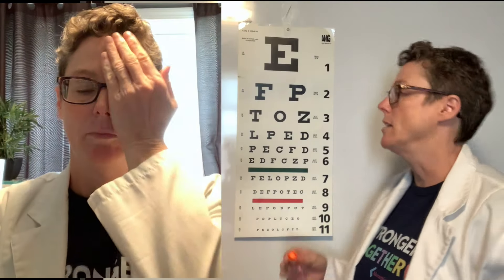You can do the test without glasses and with glasses. We definitely want to note that in your annotation if you're doing both, but typically we'll just leave the glasses on to see what their visual acuity is. So let's begin the test.